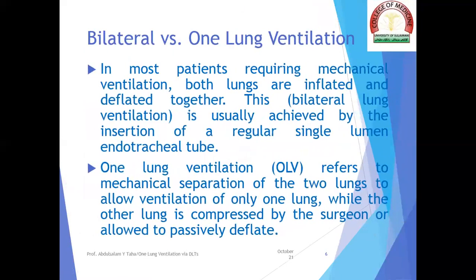So if we compare the bilateral lung ventilation with the one lung ventilation, in most patients requiring mechanical ventilation, both lungs are inflated and deflated together.